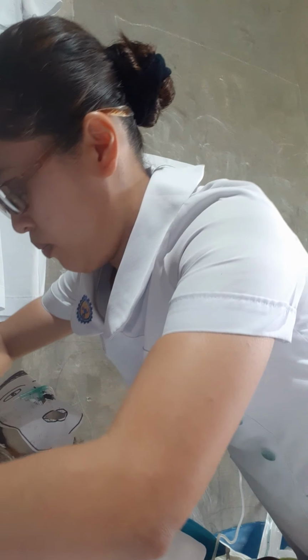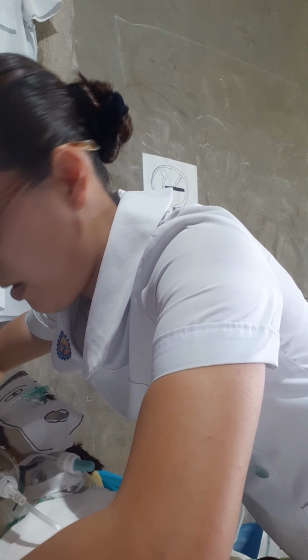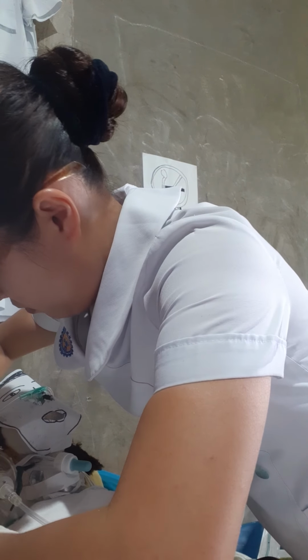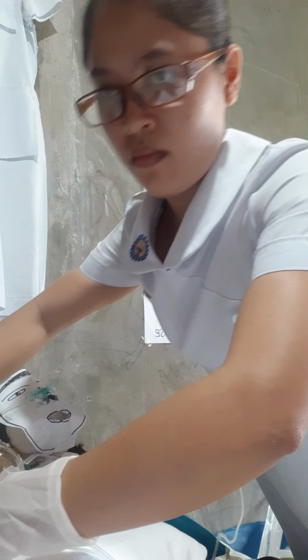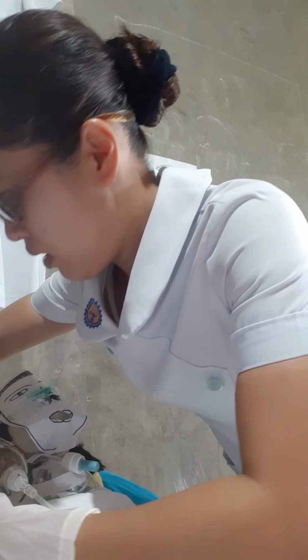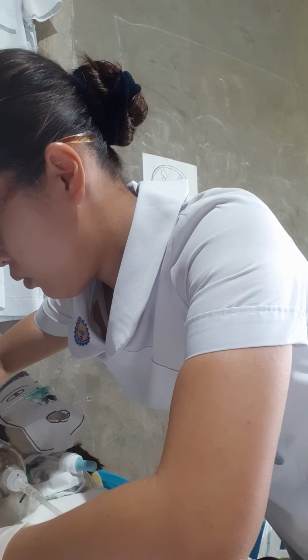Ties or tape, and we need to tie it in a square knot. Make sure that the space between the neck and the tie is one finger, so that it is not too tight and not too loose.